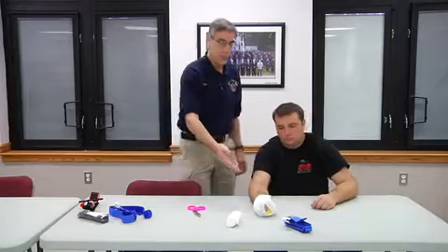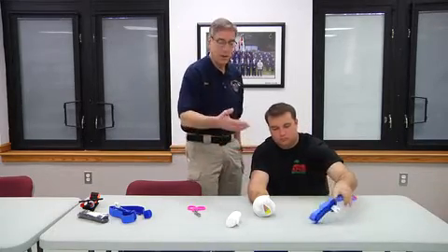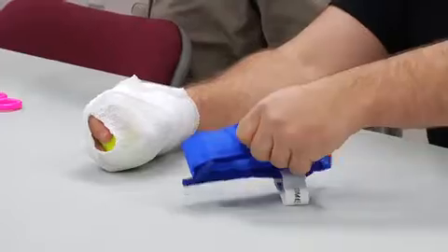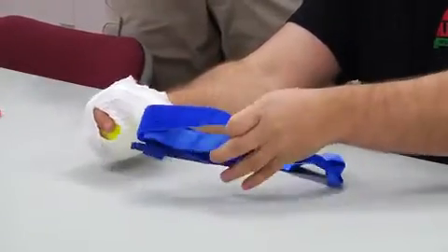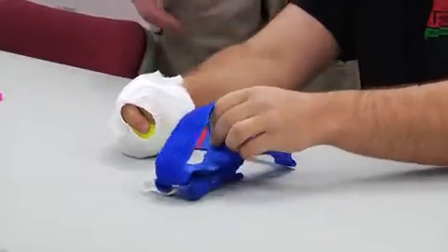So now we're going to ask the student to take the tourniquet and apply it using the other arm, very quickly, on himself. Difficult to do when you only have one hand. You can stand up.